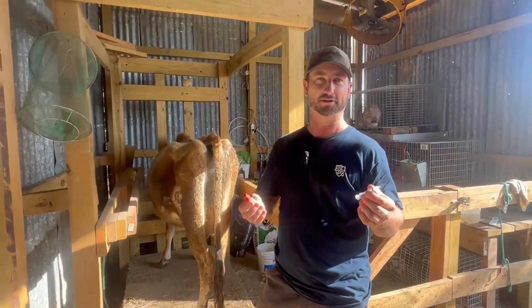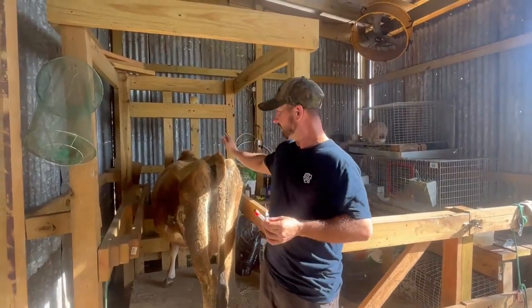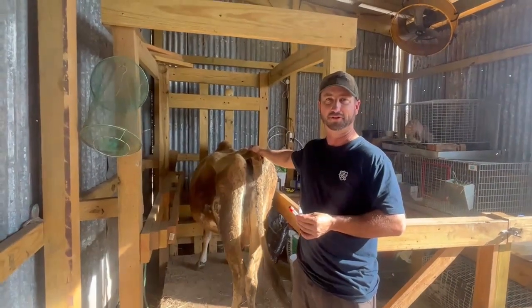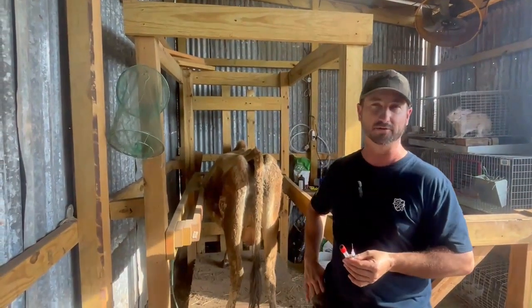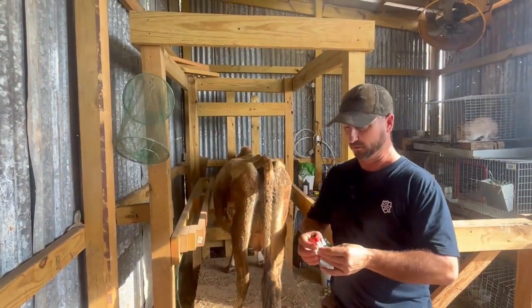Hi, this is Brian with Practical Prep TX. Today I'm going to be drawing blood from Buttercup, our Jersey dairy cow that we get milk from every day, to see if she is pregnant. We did artificial insemination on her about 31 days ago, and right at 28 days after that you can draw blood.